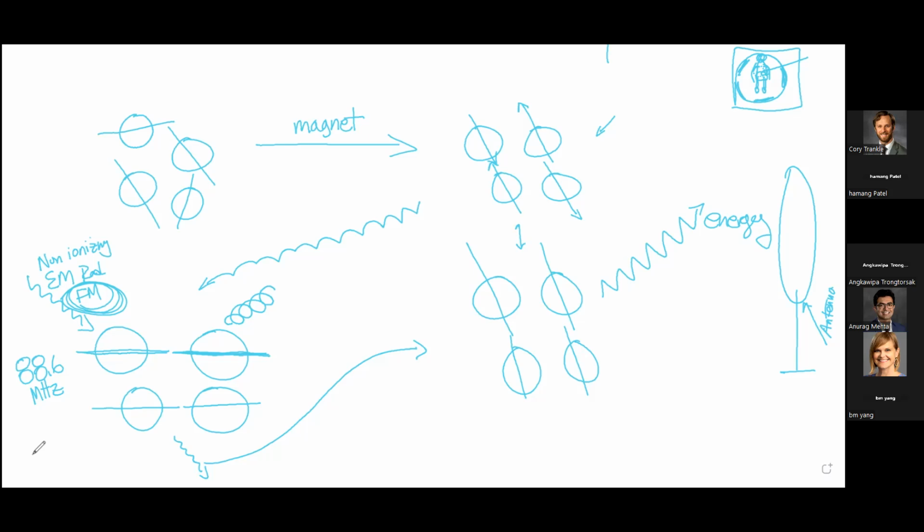Why are these pieces of equipment in a room? They are to prevent all of this non-ionizing electromagnetic radiation that is in our environment, from lights, from electrical outlets, from television, radio, etc., from getting into the room and interfering with the picture.